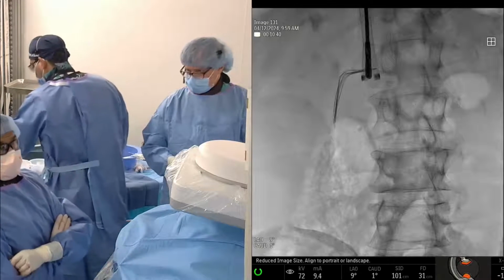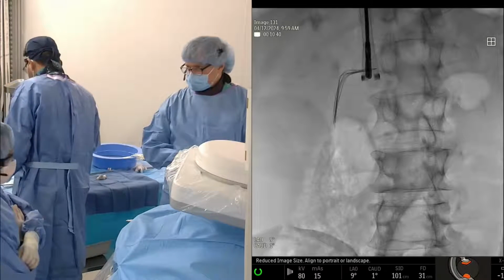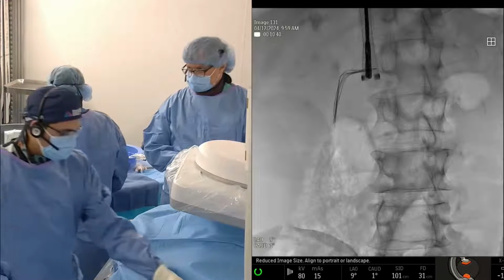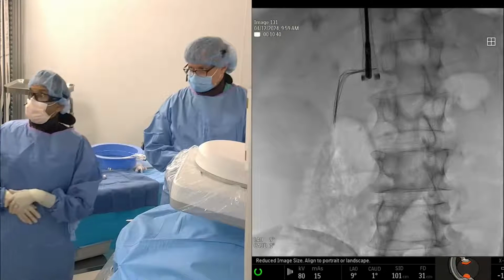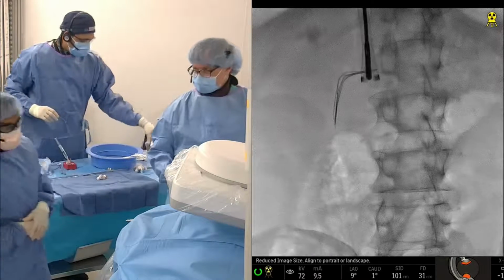Let's go up from the groin. Yeah, I think that's the best way. We have the groin prepped. The other thing you could do is hangman it from the groin and just grab it, right, and then get the forceps, put a 20 French on the thing and grab it, right, to pin it once you can let go of it.